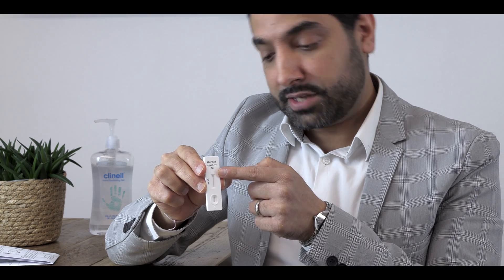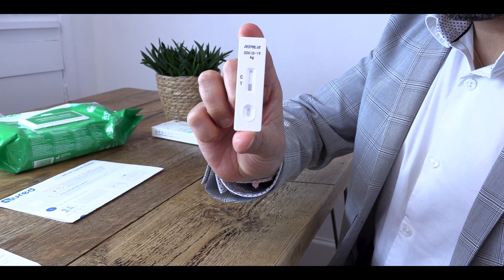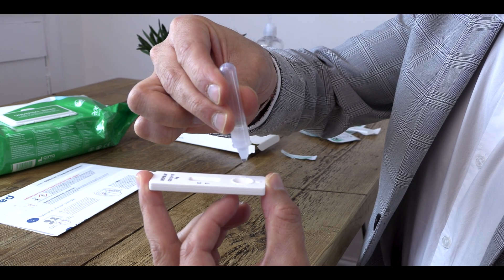The next part involves placing the sampling solution onto the testing cassette. Before we do this, take note of the different sections of your testing cassette. This is the results section and the S signifies where you place your sample. Make sure it's on a flat surface. Turn the extraction tube upside down and place two drops into the sample well. At this point, set your timer for 20 minutes so that we can interpret the results.